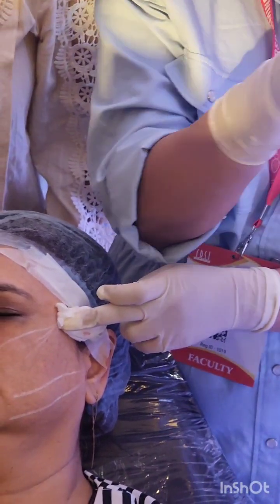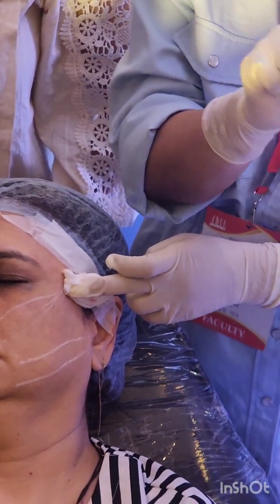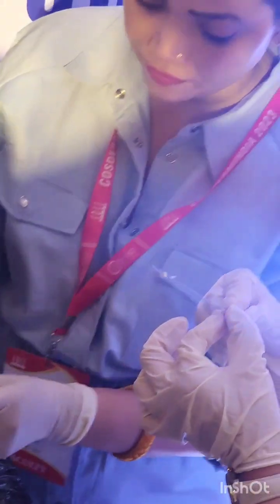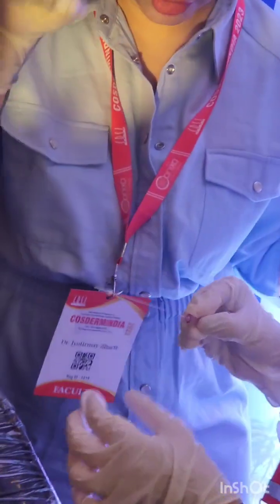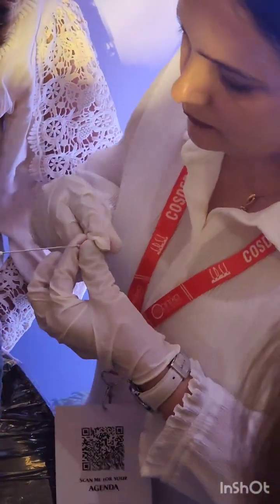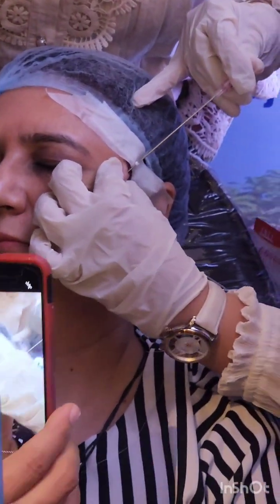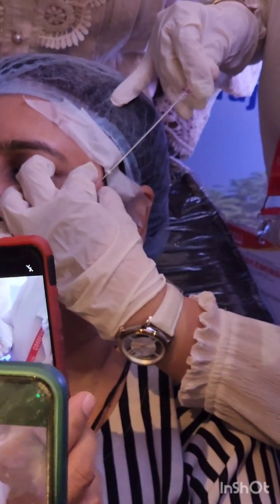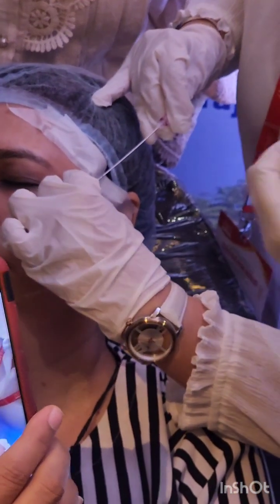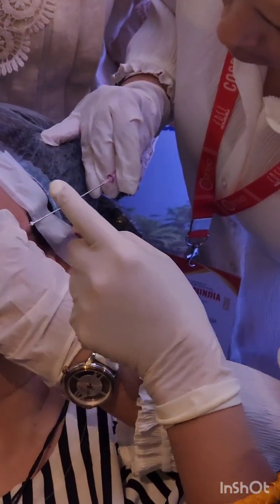So you will pull it. Now we have done this. Don't touch the needle. Don't touch the needle. Put your finger on the head. It should not slip. Bevel down. Perfect. Go to the entry. Vertical. First vertical and then parallel to the skin. Come here, I'll help you. Yes. Go vertical. Good. And apply force. Little more force. There is no harm. You have to follow the line, so you cannot obstruct it. Yeah.